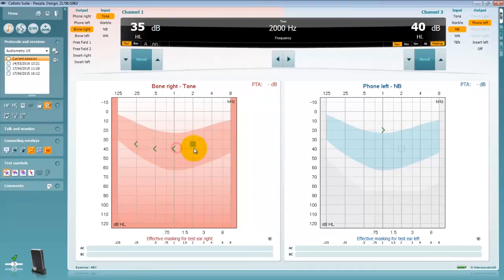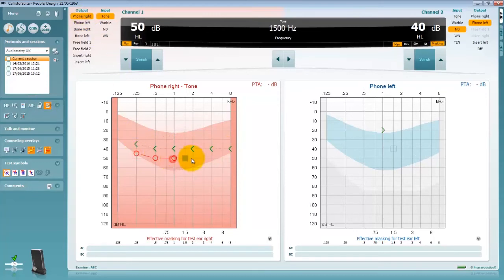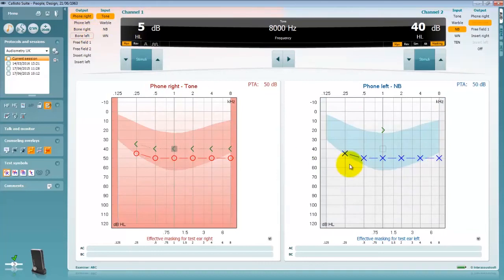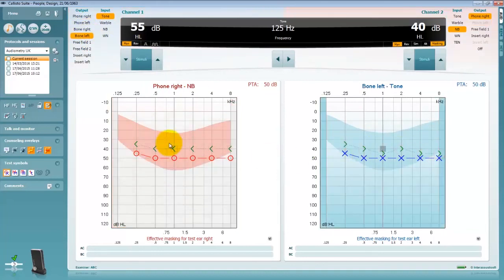Your audiometry symbols will automatically change based on the condition you are stimulating under. For example a masked symbol will appear if you have enabled masking.